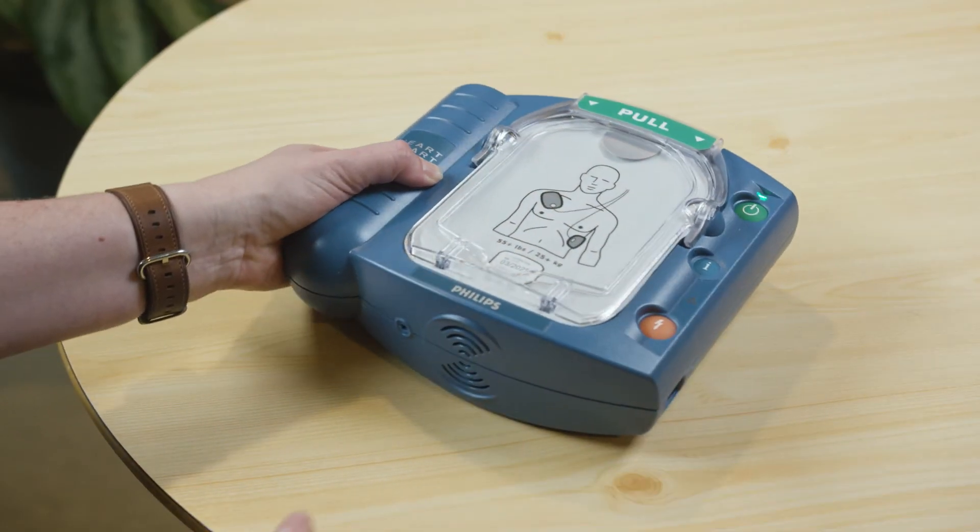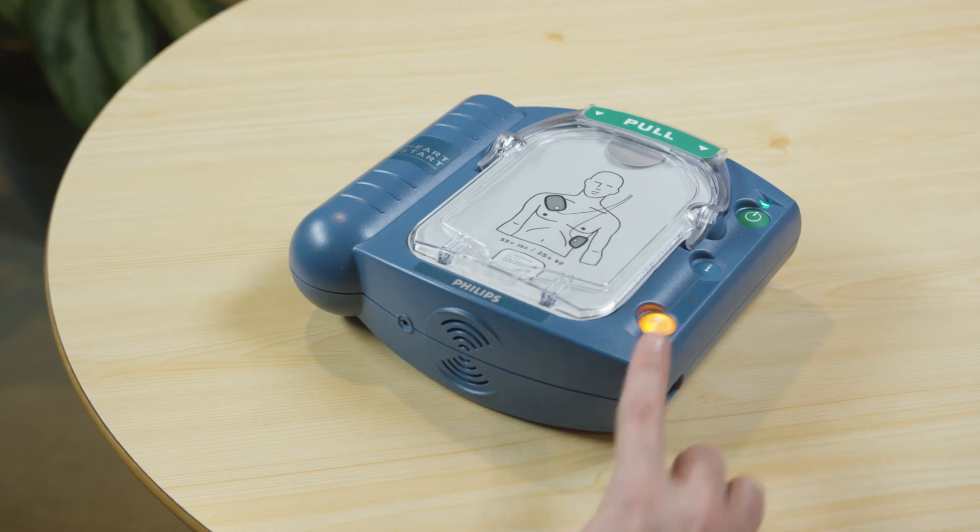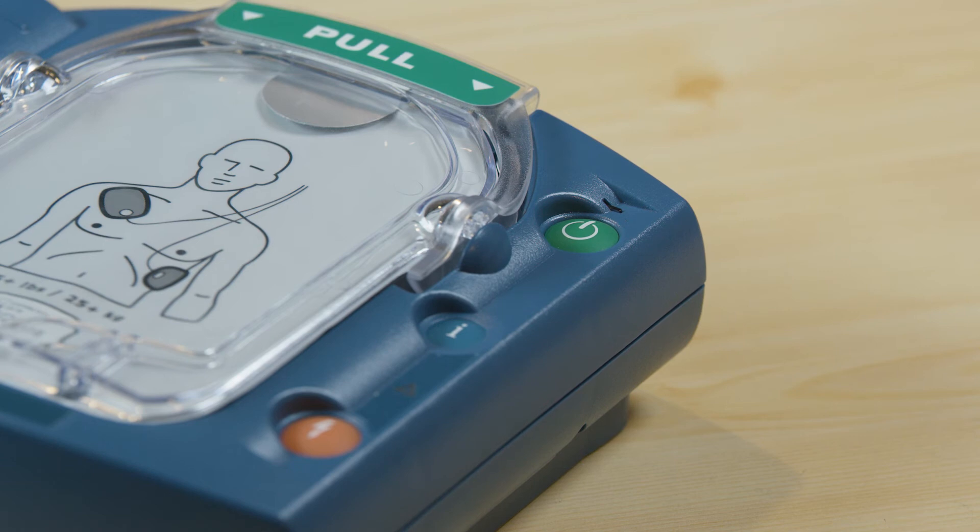As soon as the new battery is inserted, your defibrillator will automatically begin a comprehensive self-test. If the orange button is flashing, press it. After passing the self-test, your AED will be in standby mode and ready for use. All you need to do is make sure this green light is blinking.